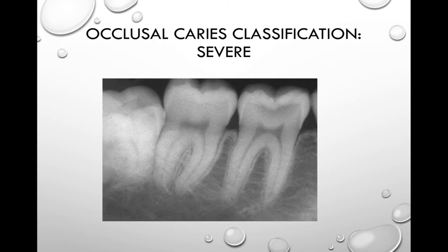Severe occlusal decay is a caries lesion that extends into the dentin and appears as a large radiolucency extending under the occlusal surface of the tooth. Once caries has progressed significantly, the enamel is undermined and can collapse. On this radiograph, we see a very large severe occlusal caries.